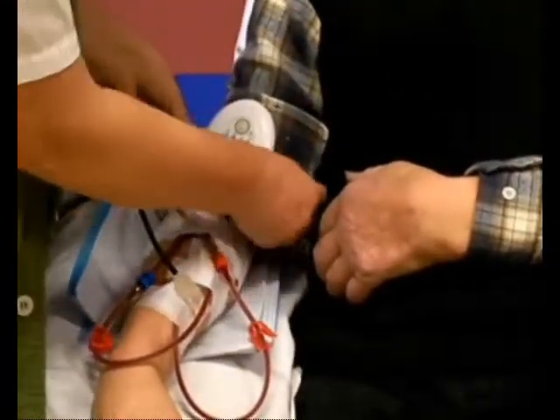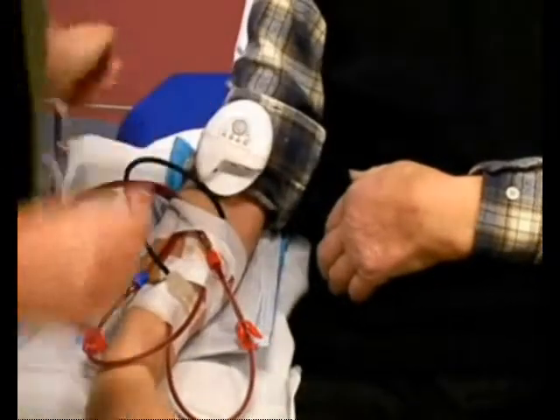If the patient is wearing a tighter fitting sleeve, the alarm unit can be fastened to the sleeve using the clip.